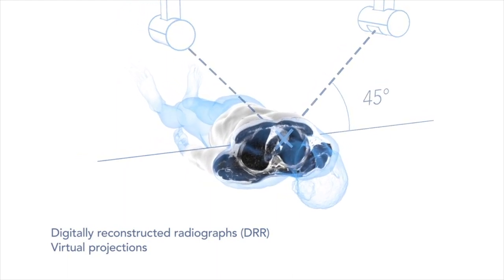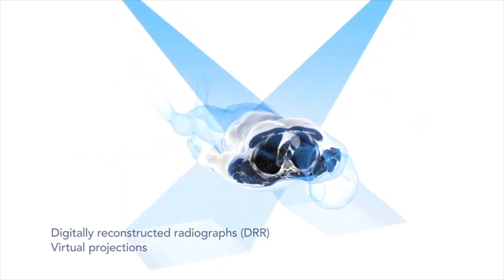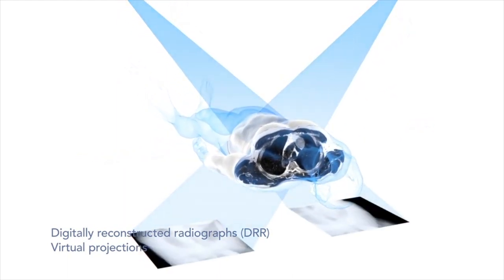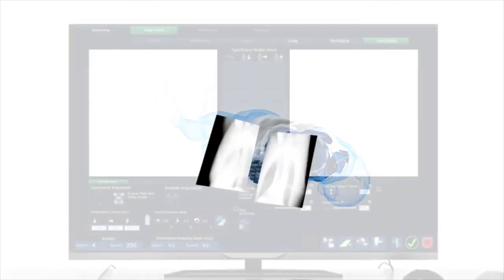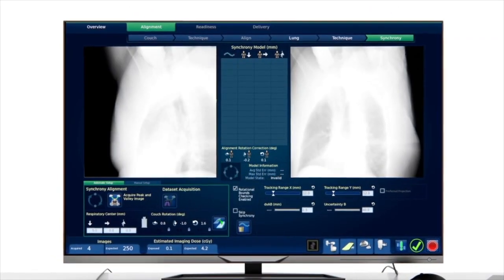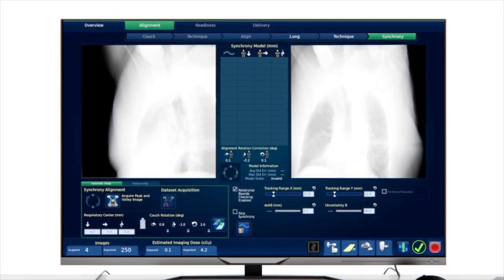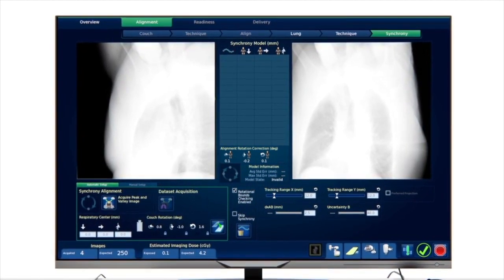These are virtual projections at a 45-degree angle perpendicular to the patient couch. Transferred to the treatment delivery software, they are later used as references for pre-treatment patient positioning and real-time motion tracking and correction.